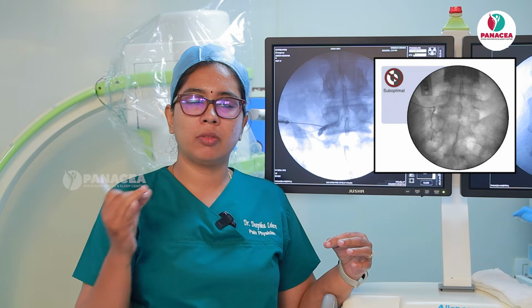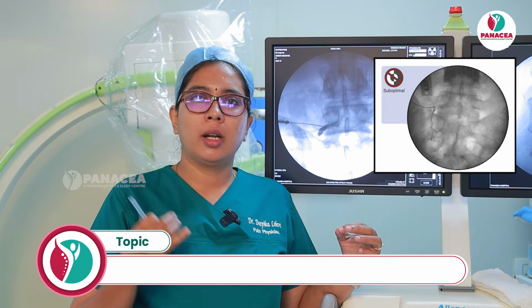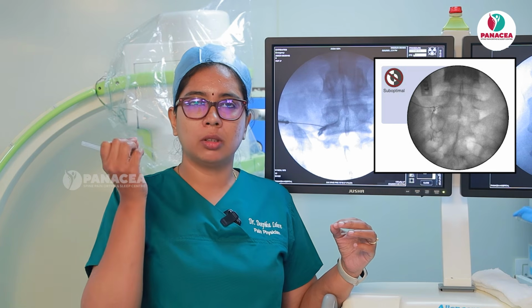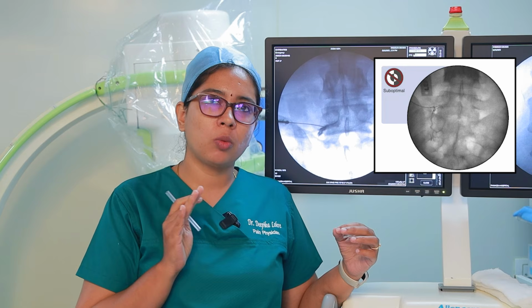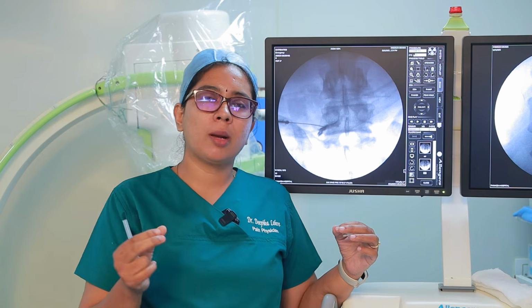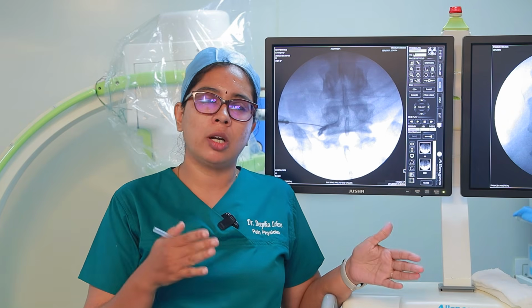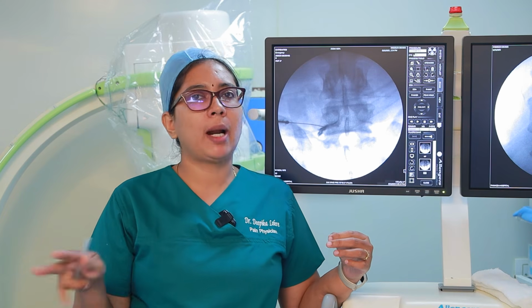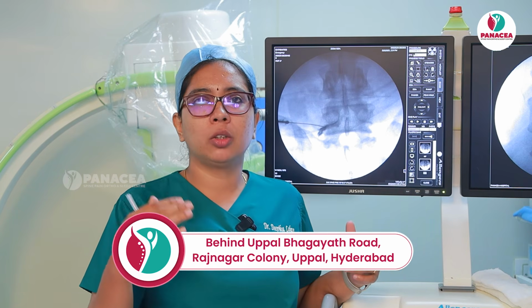You should never give the drug if there is a vascular pattern, especially if you are giving a particulate depot steroid. You should never give a particulate steroid in a vessel, because the particles are so large that they can block these vessels. So we don't want any kind of bad consequences of this procedure. If you are a beginner, try to avoid particulate steroid, because both types of steroids, particulate and non-particulate, will have similar effects. So go with the non-particulate.